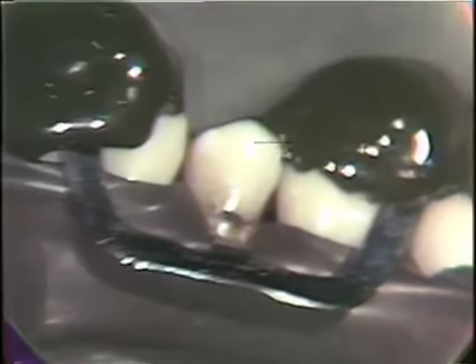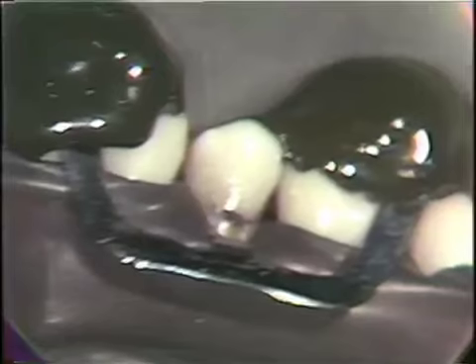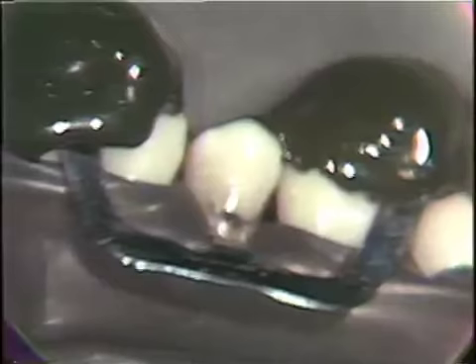We now have the Class 5 carious lesion isolated. We observe the pencil line that was placed at the level of the free gingival margin. The 212S rubber dam clamp has been placed and fixed into position and stabilized with the high fusing compound.